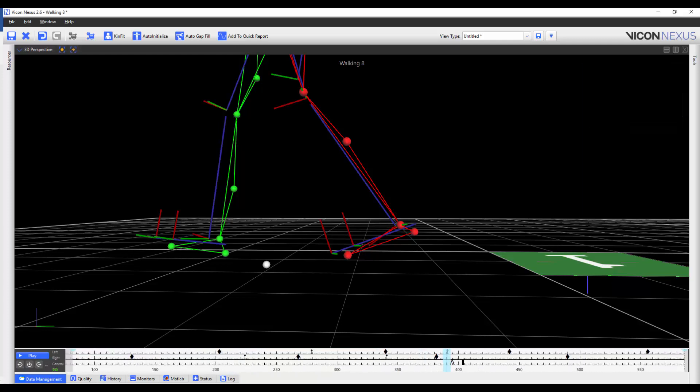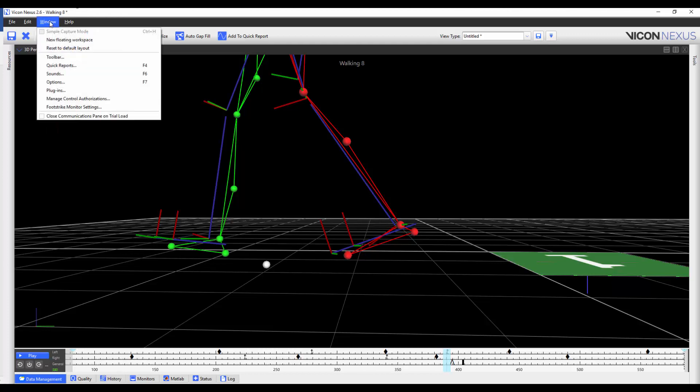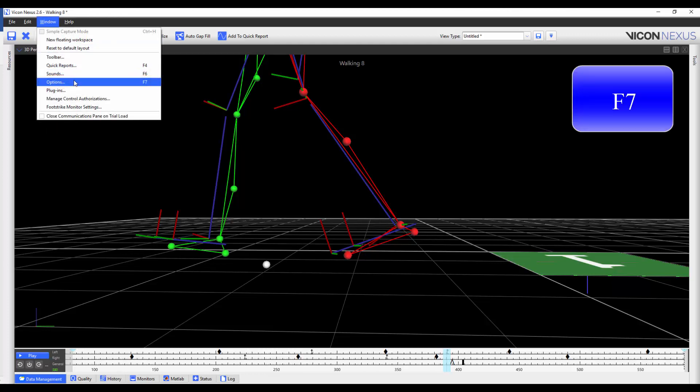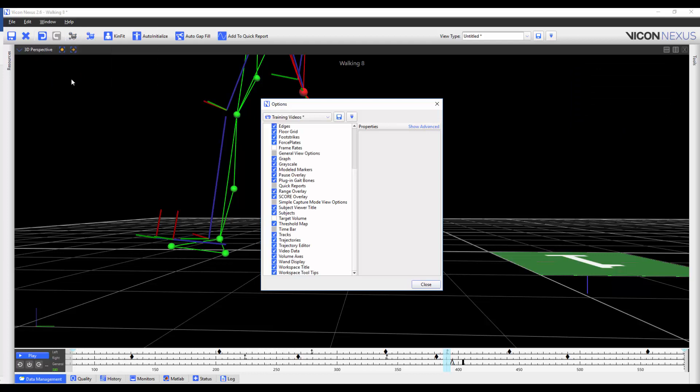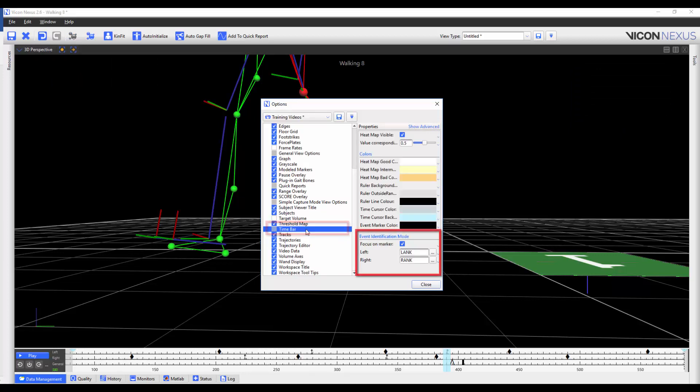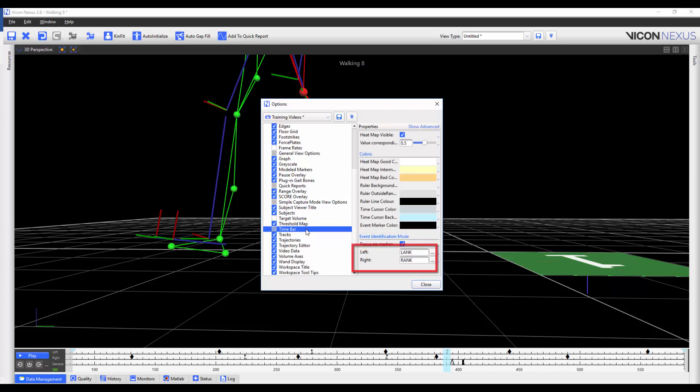To customize the options that affect the event identification mode, you can go to Window, Options, or press F7 on your keyboard. Then select the time bar, and then under the heading Event Identification Mode, you can choose to focus on the marker and pick which marker Nexus will focus the left or right context on.